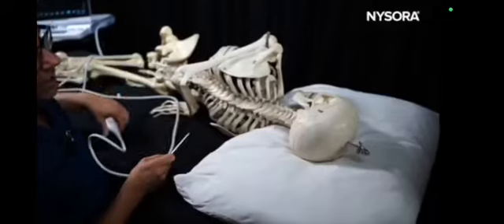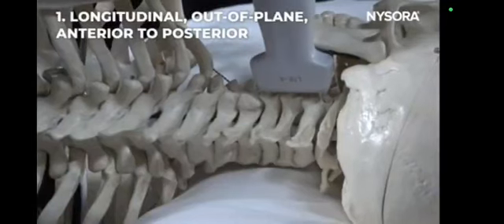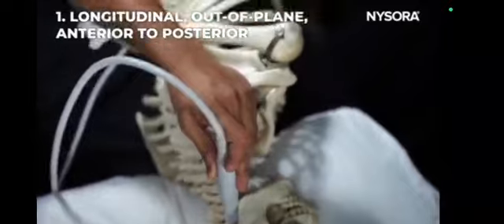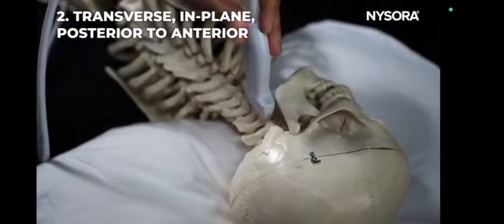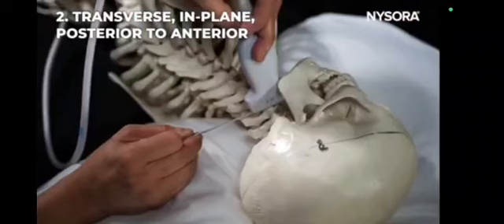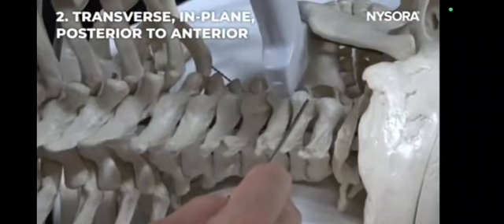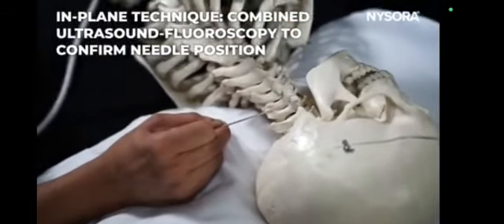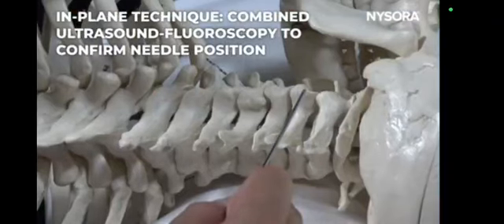Now, how would you perform the injection? You can do it in two ways. You can do it in the longitudinal view with an out-of-plane technique from anterior to posterior, or you can do a transverse view and in-plane technique. There are pros of doing the transverse view because you can see the needle tip and you will be able to identify any blood vessels. This is the same technique that you can use to perform radiofrequency treatment. So you do an in-plane technique, you put your needle under ultrasound guidance, and then you do an X-ray. I call this a combined ultrasound fluoroscopy technique, or CUFF technique.